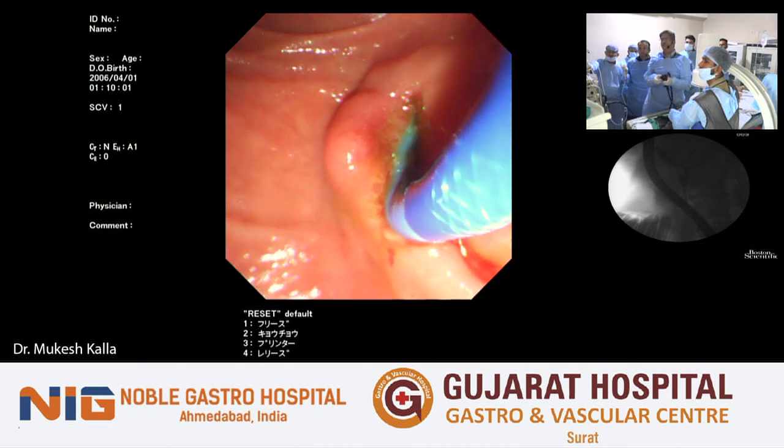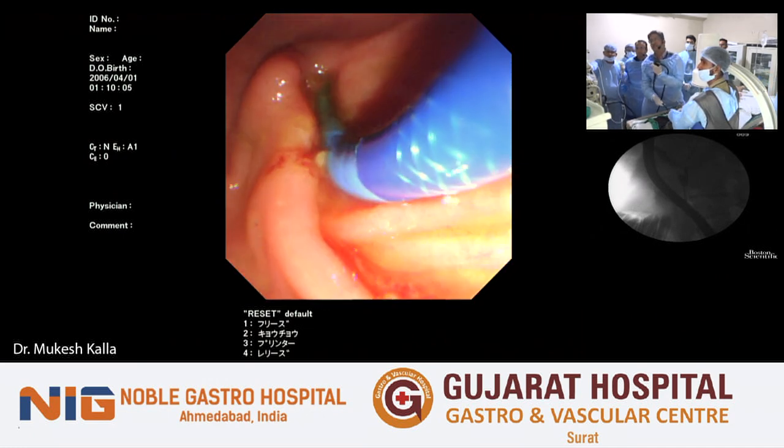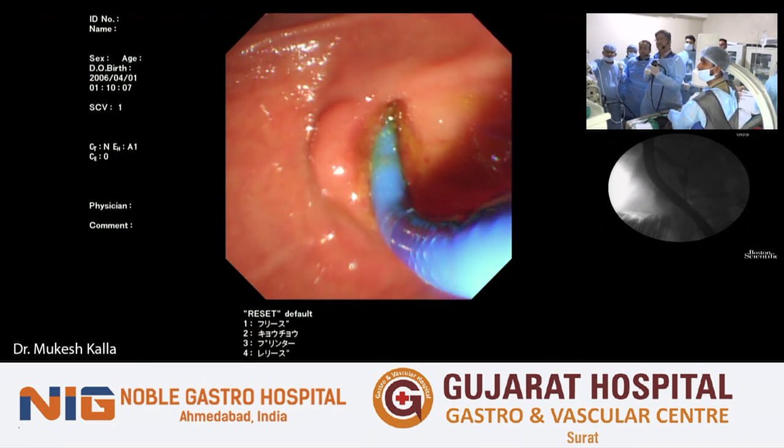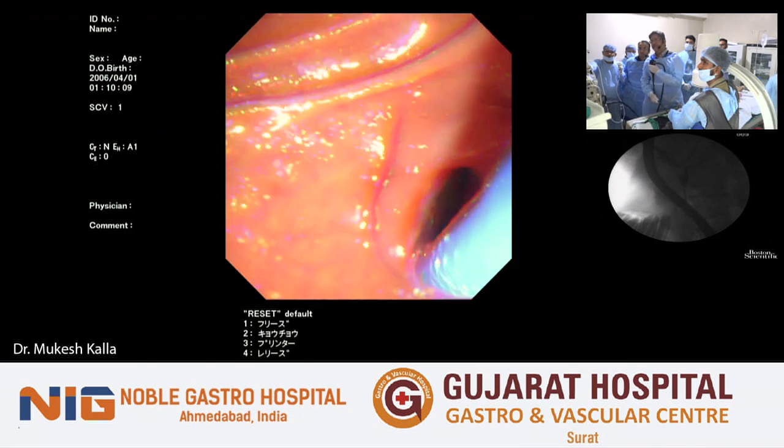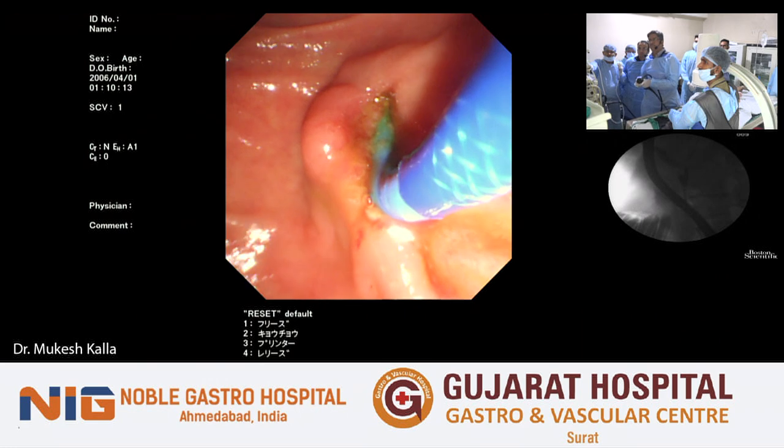The cholangiogram which me and Somil had taken was showing that the lower CBD is extremely narrow. So I will try getting inside. If I am not able to do it, then probably I might use the wire technique.